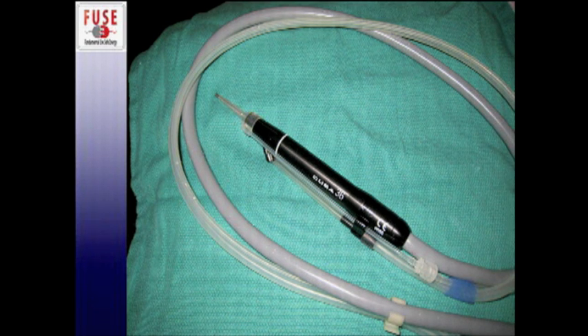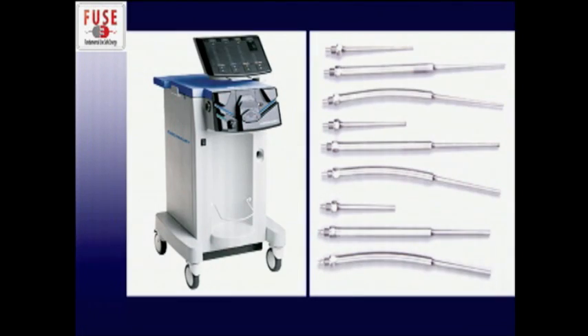It's connected to the irrigation and suction apparatus, as well as the tubing that connects to the main generator and the main console with the control unit that you can see in this picture. It comes with a wide variety of tips depending on its application.